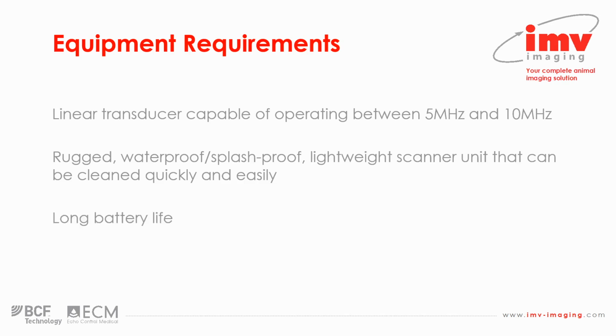We want it to have as long a battery life as possible. Obviously the fewer batteries, and the fewer number of times and length of time we have to charge them for, the better. And we will of course need some kind of viewing device. Modern equipment tends to come with either goggle type devices, and they may be wired, or we now actually produce wireless goggles, or it may be some separate form of screen. That screen might be inbuilt as part of the scanner unit itself, or that screen might be separate, not wired in, and connect wirelessly.